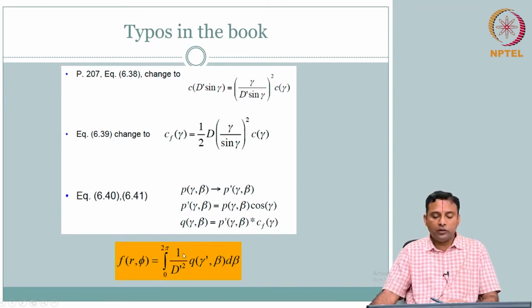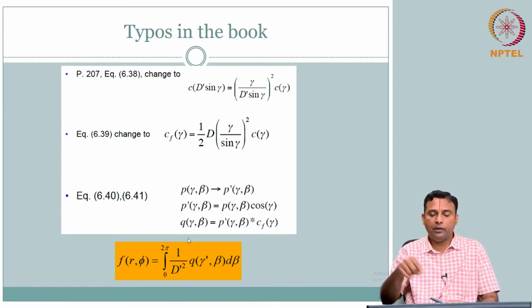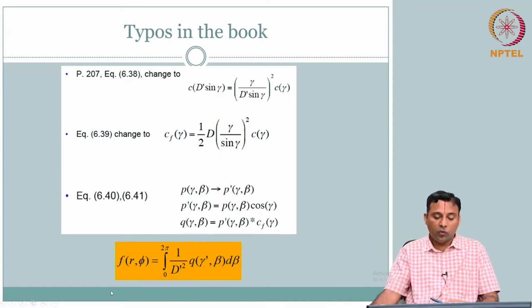The only new thing is this term. What is this d dashed? We saw in the previous slide that d dashed is the distance of the point from the source. So for the convolution back projection for fan beam, a slight difference has happened. Without this term, it is filtered back projection, where the filtering is implemented by convolution. So convolution back projection is what this is, the same as what we did for parallel, with the geometry change.